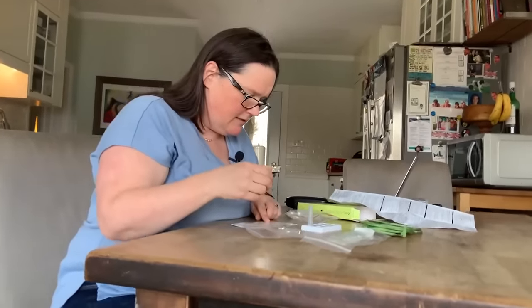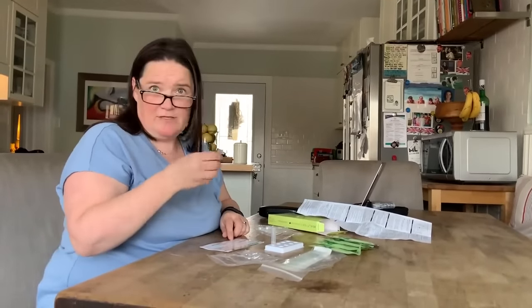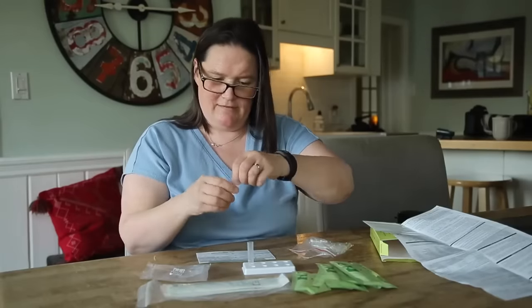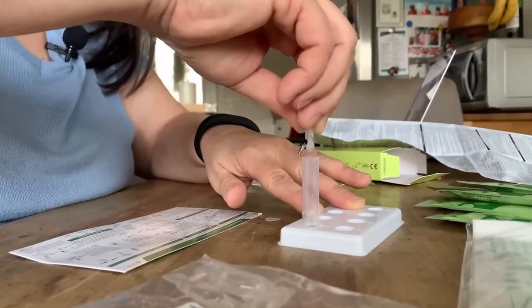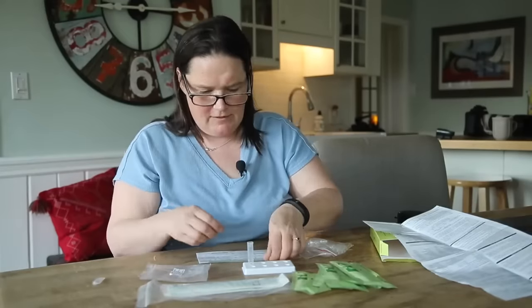Now empty the entire contents. Gently mix — is this gently mixing? It's probably gently mixing. Let me open this. There we go, and put it in here. That looks like everything is in there. I guess this can go into the bin.